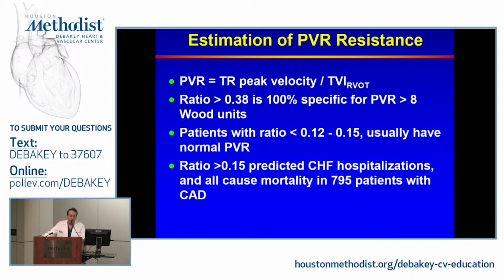They are doing this not because their pulmonary vascular resistance is up or is compromised. They are doing it because the stroke volume increased. And so Dr. Schiller and his group introduced this concept of saying, let's get a PA pressure estimate and let's get a cardiac output estimate, and the ratio between them should give us an idea about the pulmonary vascular resistance.